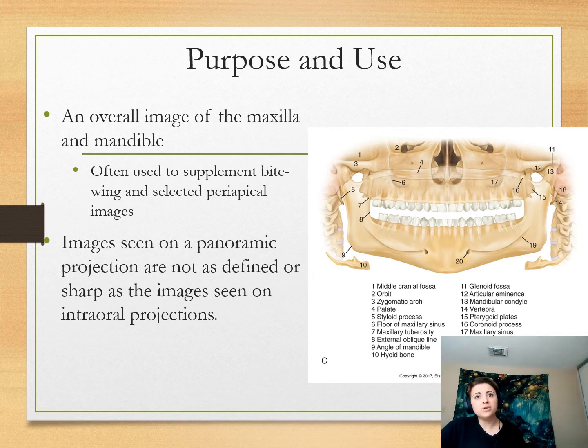We see this a lot too for people who have congenitally missing teeth. So we take an intraoral and we don't know if the tooth is there. So we take a pano to find out, is the tooth impacted or do they not have it at all?